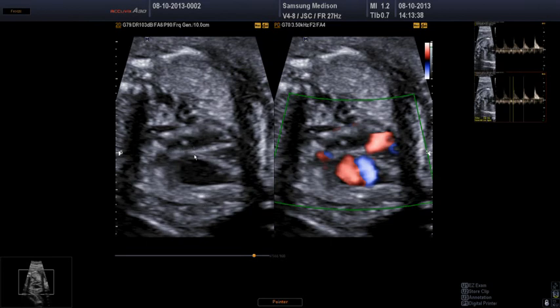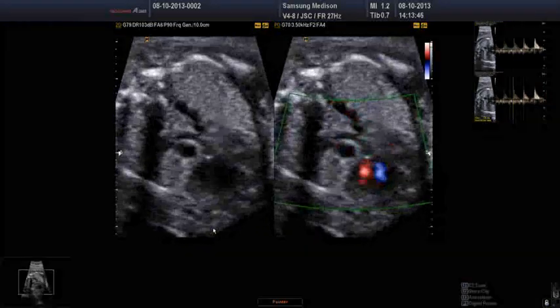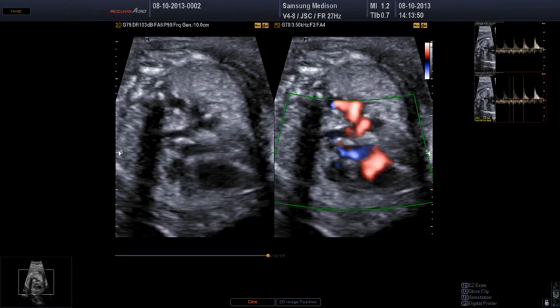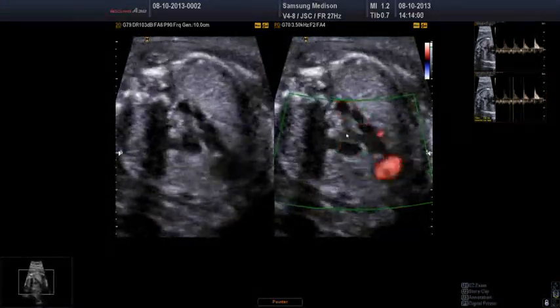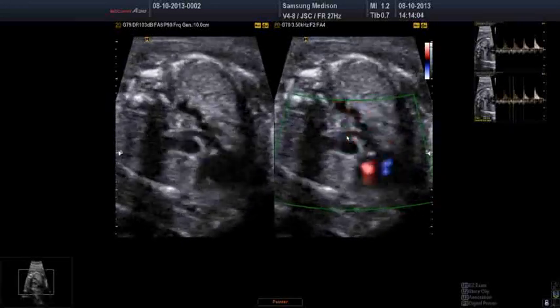And your right ventricular outflow tract is going to come here, but you see you're already seeing some of the pulmonary bifurcation there. And as we move up, you're getting your bifurcation of the pulmonary artery. So this is on the right side of the heart. And bifurcation here, the right and the left. The duct is going to come in the middle. There it comes. Then you get your aortic arch. So it's a very well behaved baby, this one.